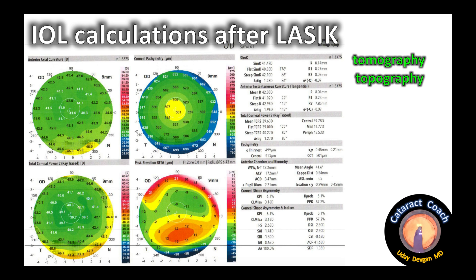Next we have a printout from a dual Scheimpflug tomographer, which also has a topography component but importantly takes many slices through the cornea and pieces together a 3D map. Looking at the four pictures on the left: the top left is the anterior axial curvature, similar to the previous test. The bottom left corner is the total corneal power via ray tracing — notice how the central corneal power is a little bit less with ray tracing. The white ring shown there indicates the centration of the pupil.